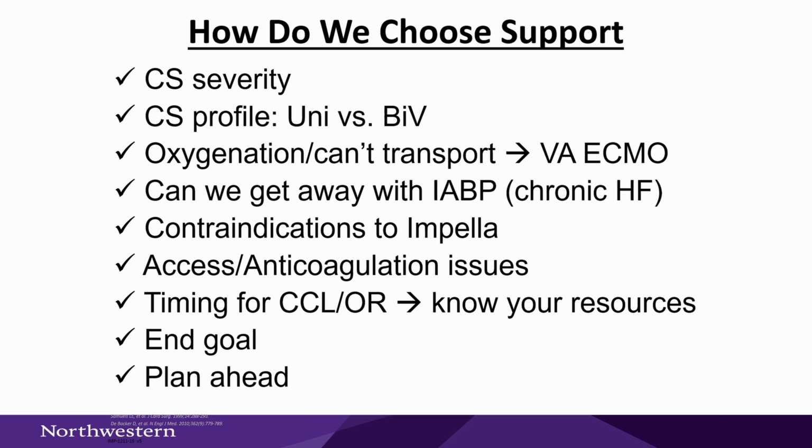All the wonderful data that the 2 prior presenters talked about was in acute MI shock, and it doesn't really apply to heart failure shock. And in fact, I think someone mentioned the data from Columbia, which is a wonderful paper that shows that chronic heart failure patients tend to respond better to balloon pumps. As we're evaluating patients, we're immediately thinking about contraindications to Impella. They do provide more support than balloon pumps. So we're thinking about all this kind of simultaneously.